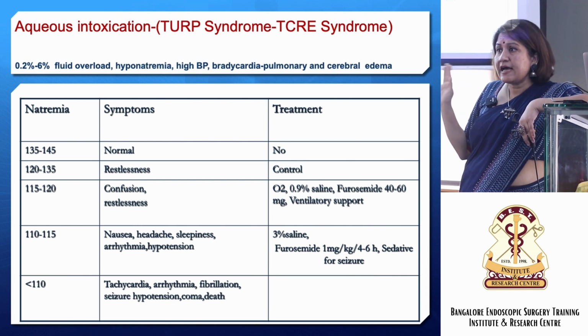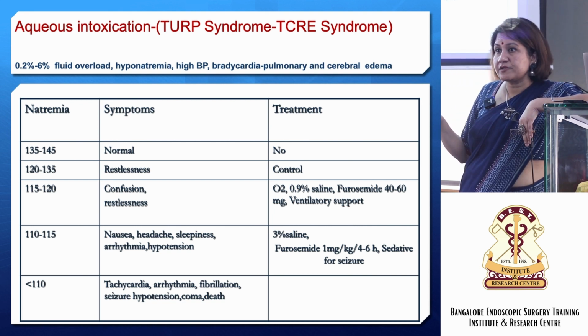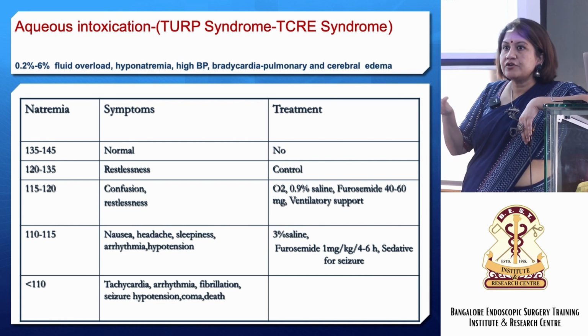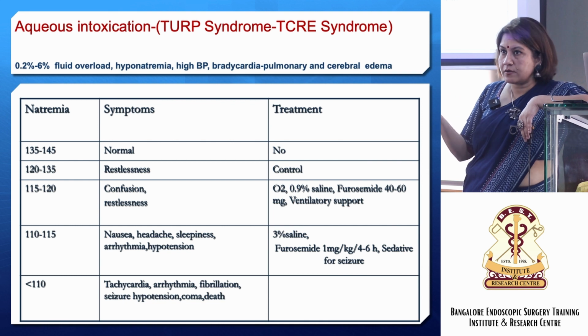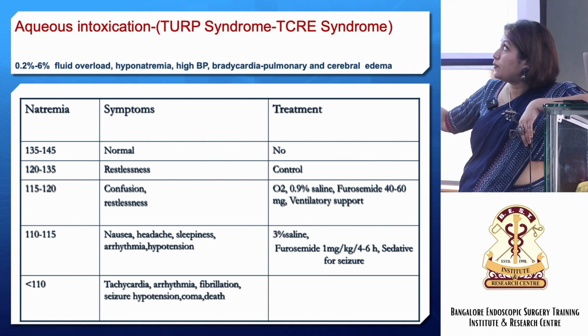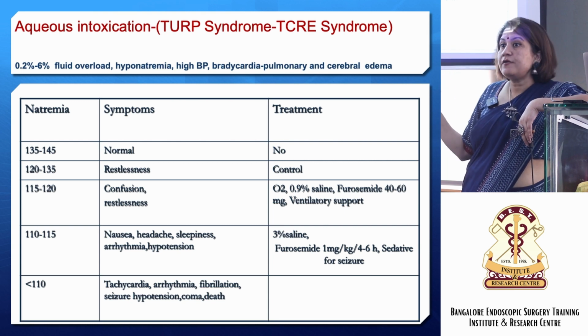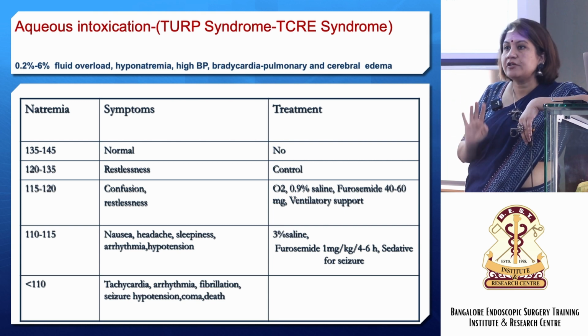So, this has happened in the past for a simple operative procedure. That's why you need to have monitors whenever you're doing an operative procedure, which definitely should include ECG electrodes and something that monitors your blood pressure. Pulse oximetry is required for operative procedures, and regional anesthesia is preferred for operative hysteroscopy, especially if you're using glycine.